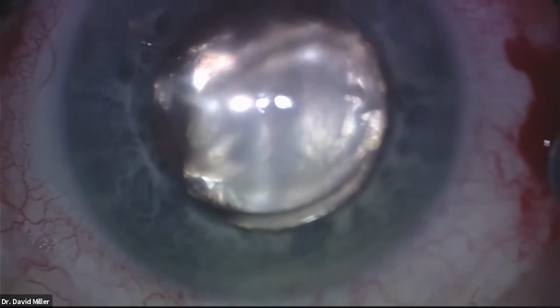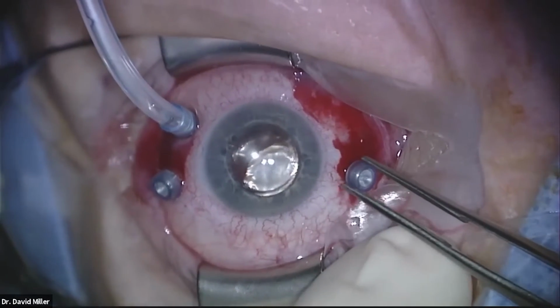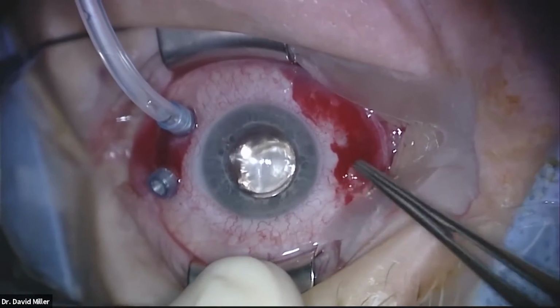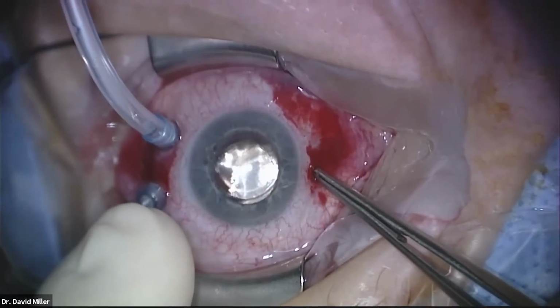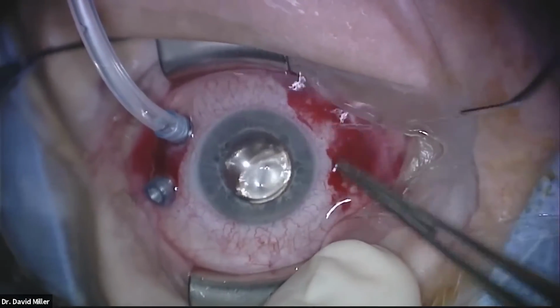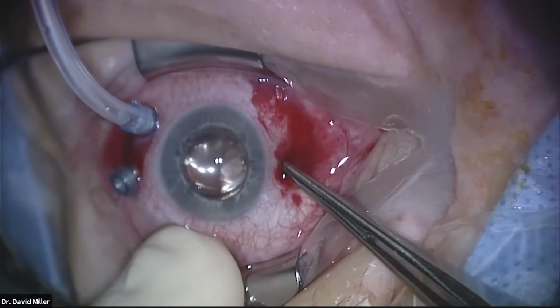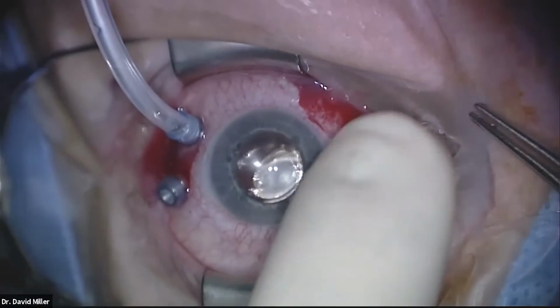And now we're going to swap out the air for the gas. Yeah, so we're going to pull the one sclerotomy site on this side. I'm going to press this sclerotomy site closed with my forceps because there was a bit of an angled incision. So what we're going to do is press on the top of that incision, not at the incision, but kind of on top of the tunnel to collapse it.